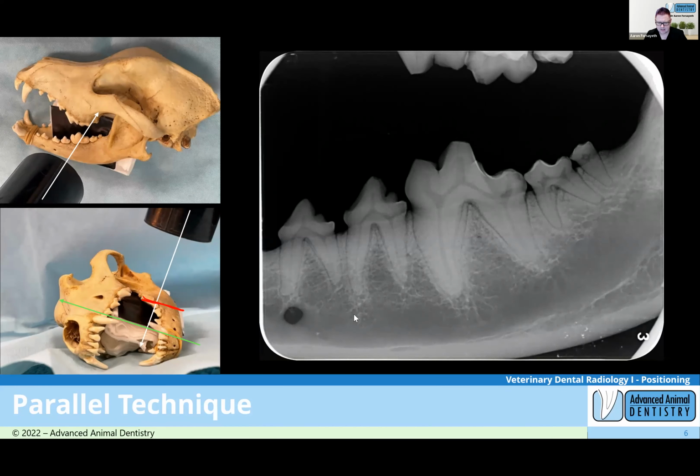On that image that we can see, just near your mouth there, Beck, you've got a big black spot. That doesn't look good. Well, what could it be? Still mental foramen. Pretty big. Yeah, you're getting all the points tonight, Karen. Well done. So that can be a trick for young players. If you have an angle where a foramen is overlying a root tip, it can be quite distracting and can sometimes look like you have periapical disease. Anyway, that's for another time. We're not going to talk about that tonight. That's parallel technique. You need to know it and you will use it.